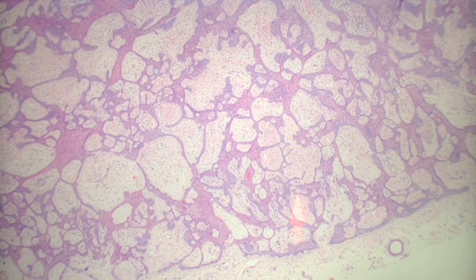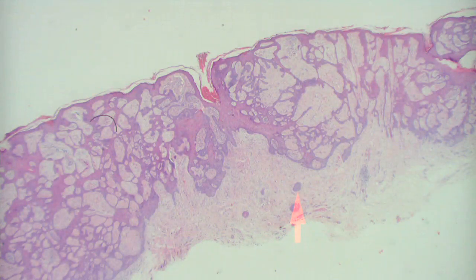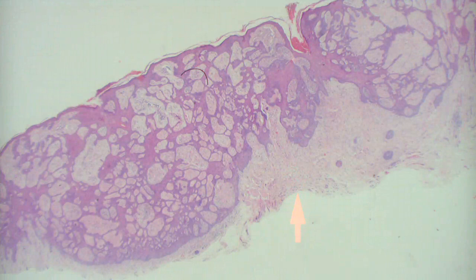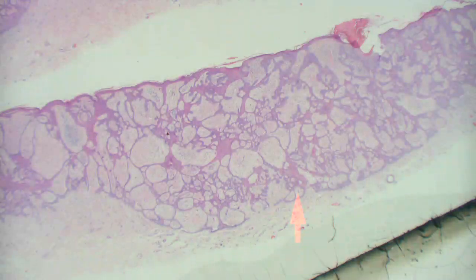What does syringofibroadenoma look like? They're very, very small and skin colored. They can look sort of like this. There's one other setting where you can see a syringofibroadenomatous proliferation, sometimes in patients that have lots of stasis alteration. Lymphedema can give you that pattern in some cases.